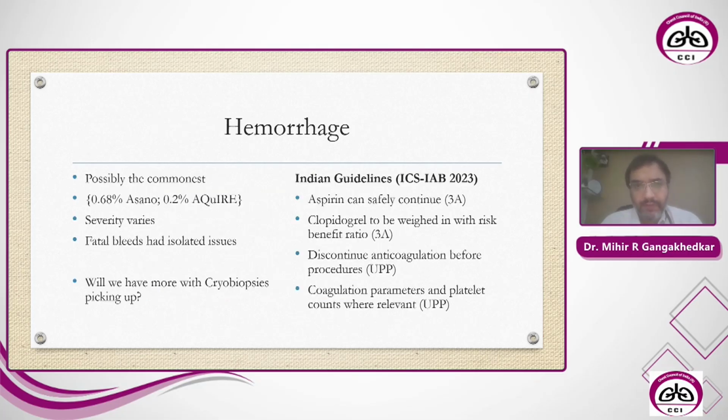And even though it is the commoner non-infectious complication, remember the numbers are still less than 1% in both of our large registries, which are cited most frequently. But are these numbers likely to pick up with the increasing advent of cryobiopsy? Possibly, time will tell.